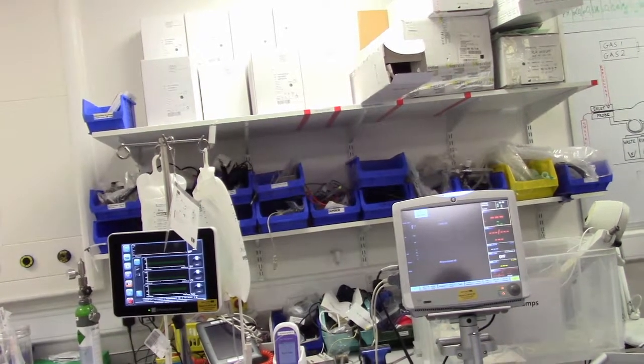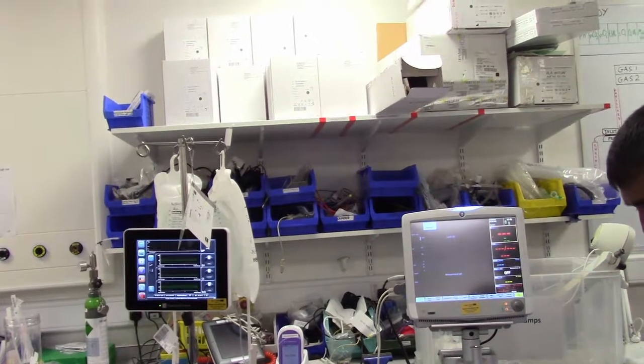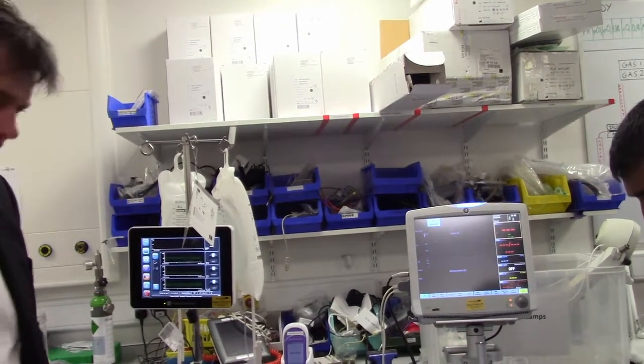Yeah, but we still take the blood sample for the gas analyzer. Of course, you need arterial access for that, right? Yes.